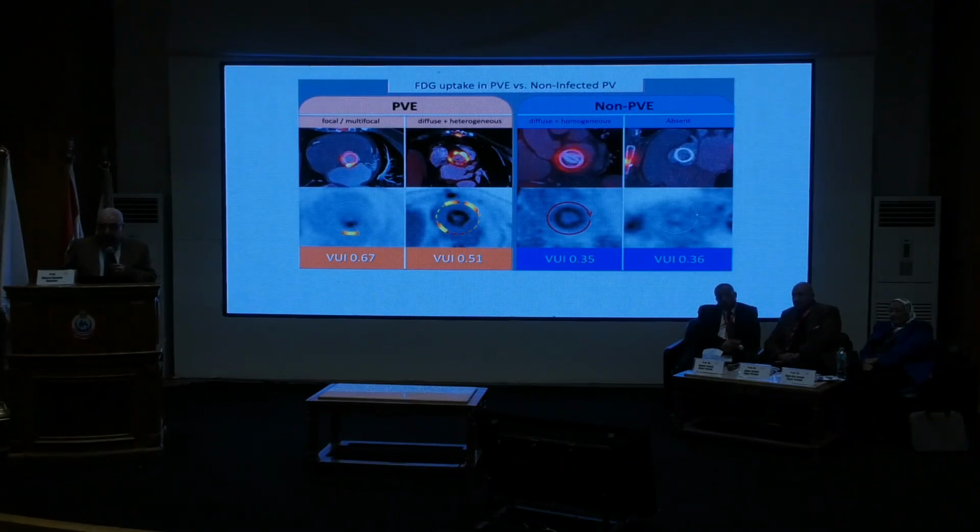I'll show you some images of the positive and negative cases. Here we have focal uptake, and here we have multifocal, diffuse heterogeneous uptake, and here we have diffuse uptake. So this is negative, and these are positive.